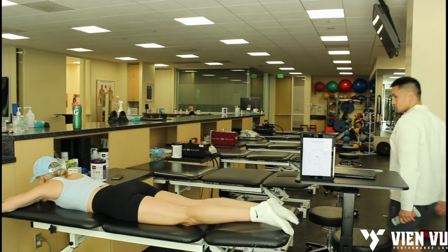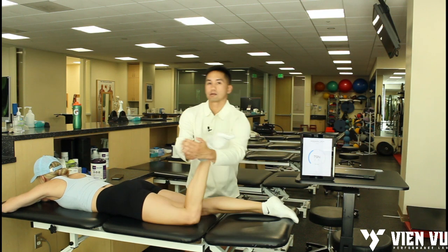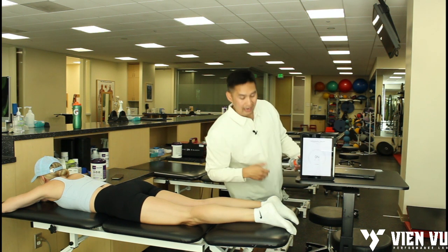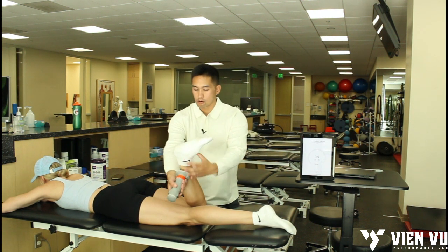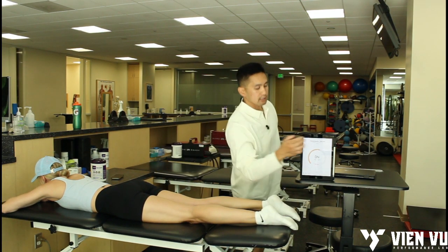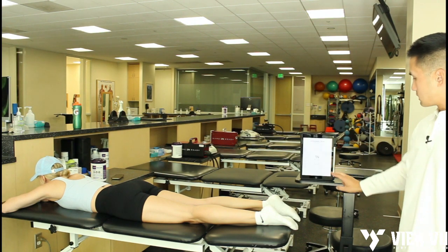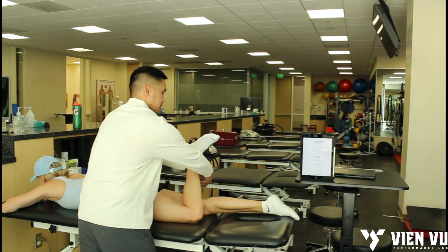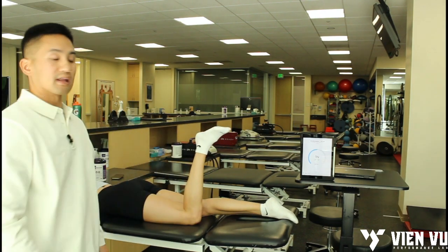Hit Start Testing. Ready and go — push, push, push and rest. From there, that's good enough for me. I'll hit Next, we're going to Start Testing, and now we're going into external rotation on the right side. I'm already in the exact position I need to be. Hold here, and go — push, push, push. Good, right there. Hit Next, Start Testing — same deal here, going to go this way. Hold and go — push, push, push. Good. And that's the left side external rotation done.